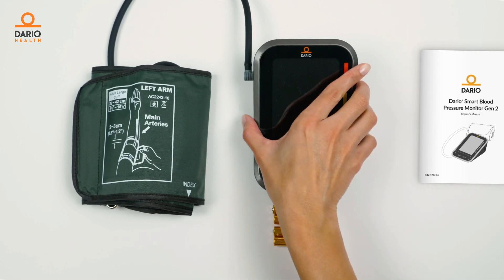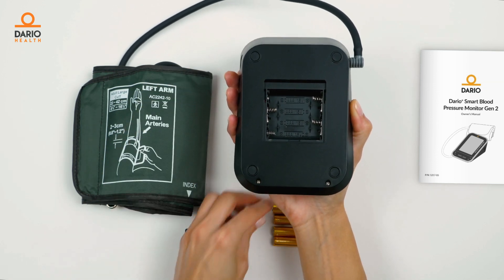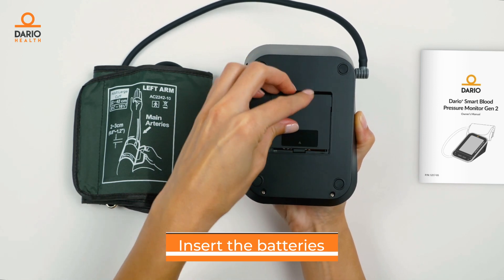Let's set it up now. First things first, open the cover on the back of the Dario blood pressure monitor. Insert the batteries and close the cover.